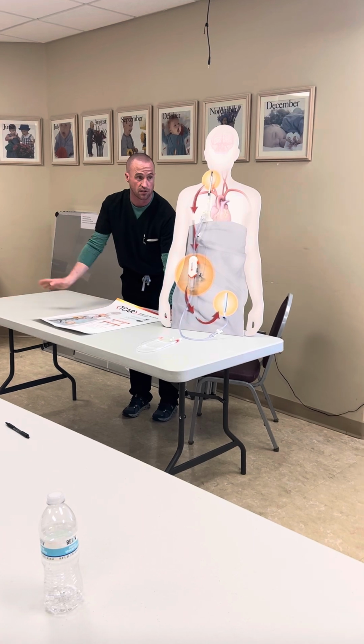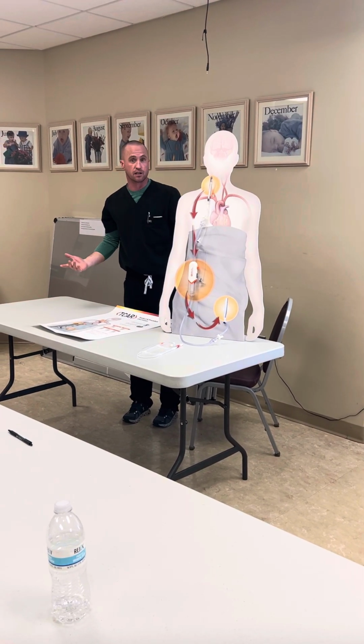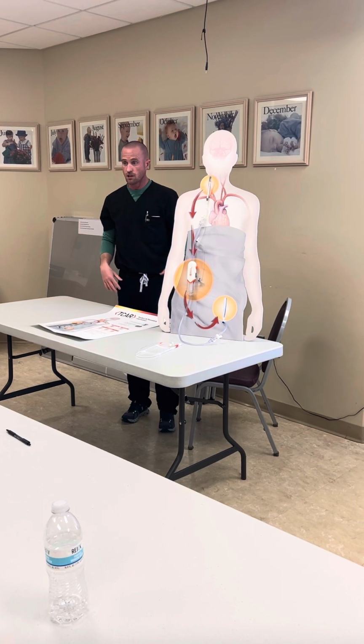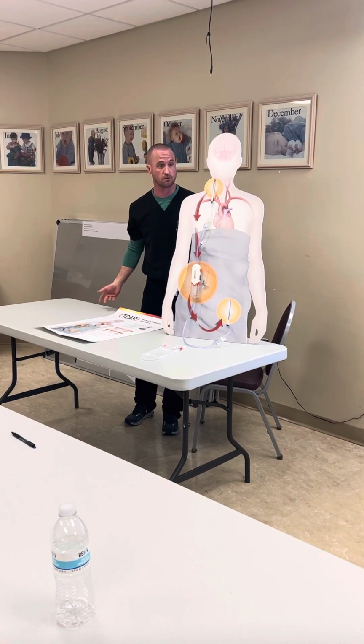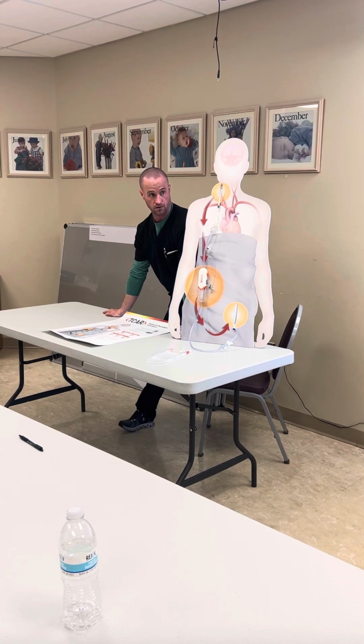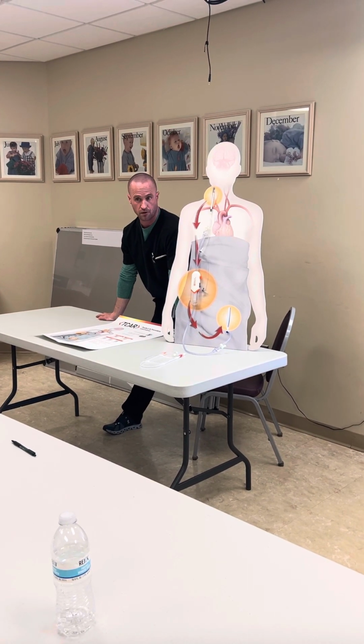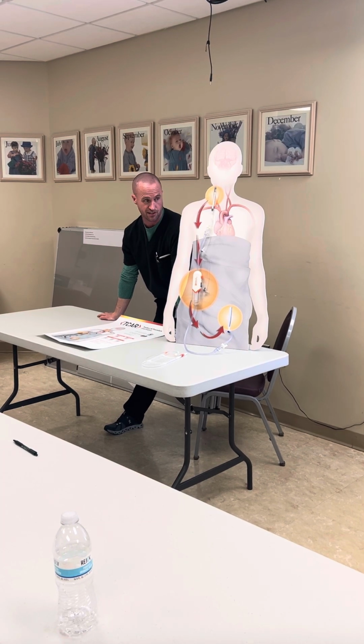And then we leave the table open and sterile up until that point, just in case we need to re-intervene. But again, not to jinx myself, we've done probably 2,000 in this area, and we've not ever gone straight back in. So I think it's a precaution we've always taken, just because it's possible.